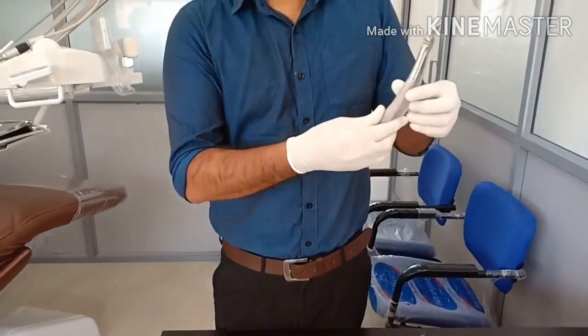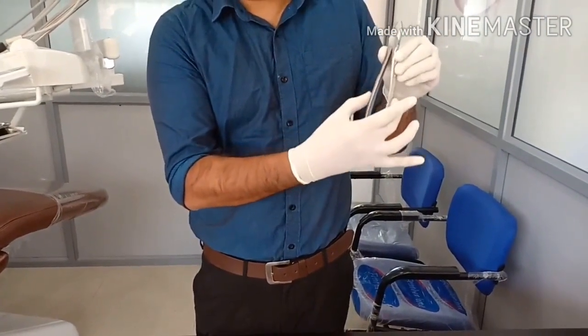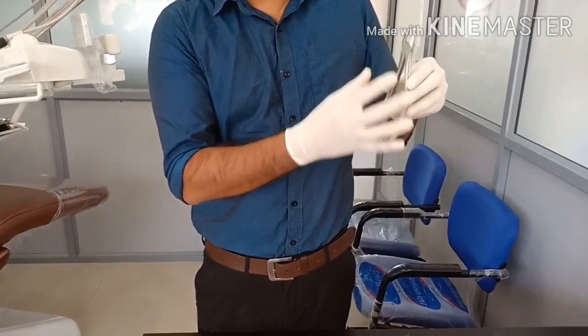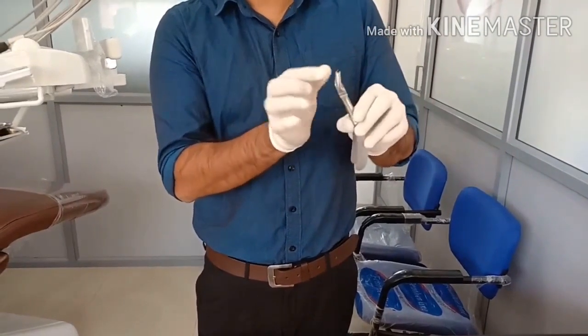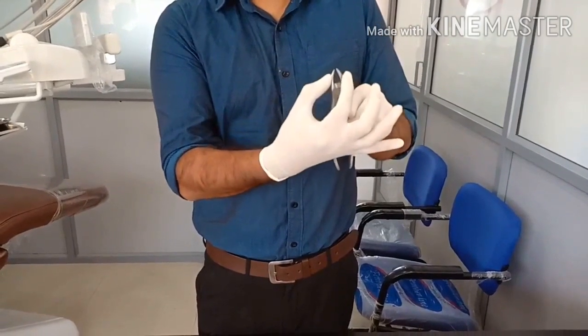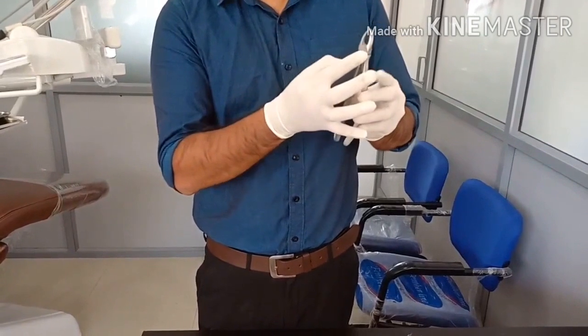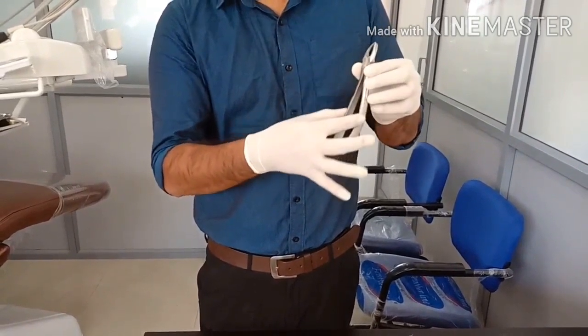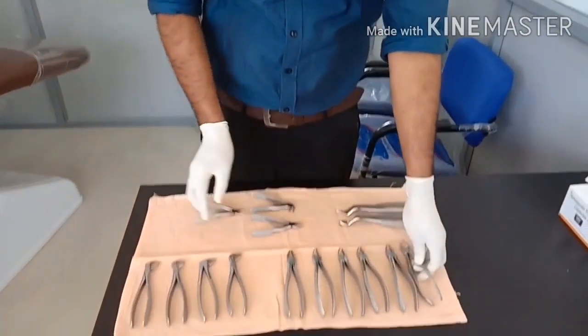This part is known as the handle — basically two handles are there — and this is the hinge joint, and these two are the beaks. There are two beaks; it looks like a beak of a bird. So two beaks, a hinge joint, and two handles make up every forceps.